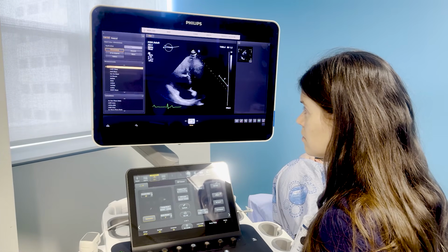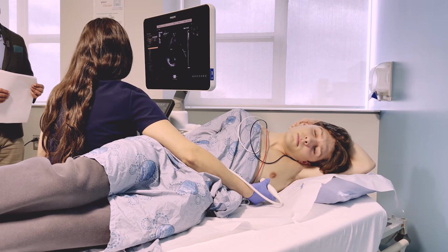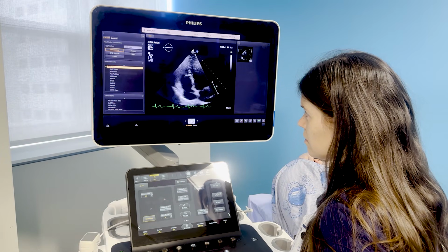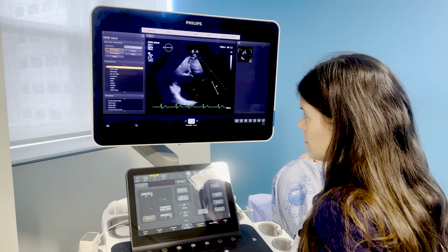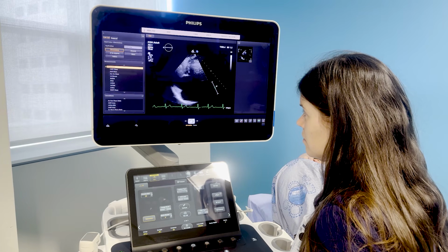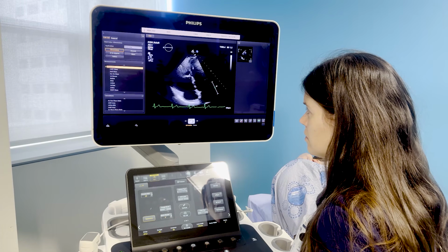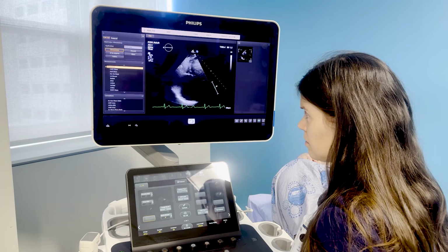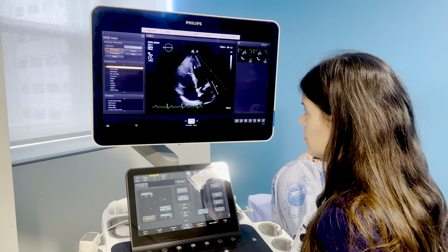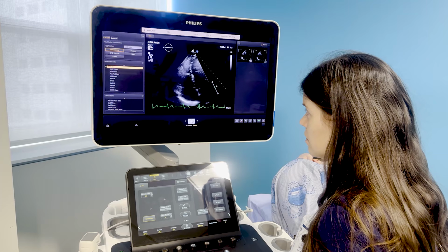Here we are getting started with the right side of the heart for our patient model, and Casey is focusing on the RA to begin with. Looking at the right atrium is important because it helps us determine whether there are elevated right-sided filling pressures and also reflects upon RV diastolic dysfunction. The RA area is also strongly associated with morbidity and mortality in pulmonary hypertension. The RA area or volume can be indexed to body surface area and should be part of standard echo reporting.